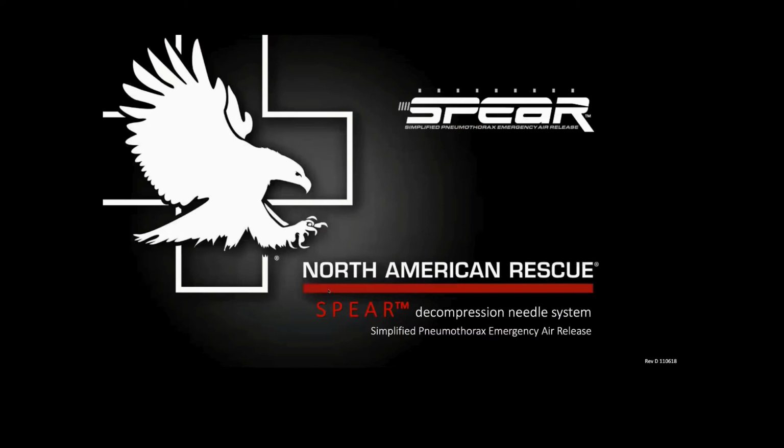Next, we're going to chat a little bit about our change to needle decompression, some of the thought process behind it. It really didn't change our guideline much as far as what's documented, but it's definitely going to change the procedure in which we go about placing these devices because it's quite different.